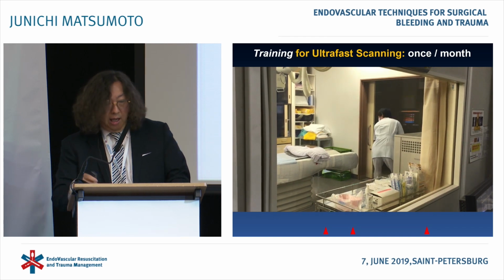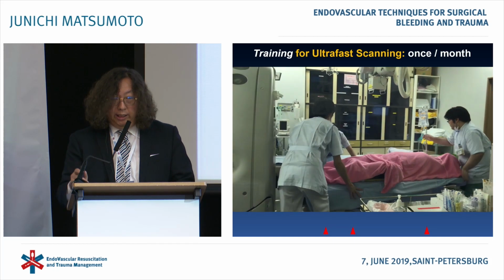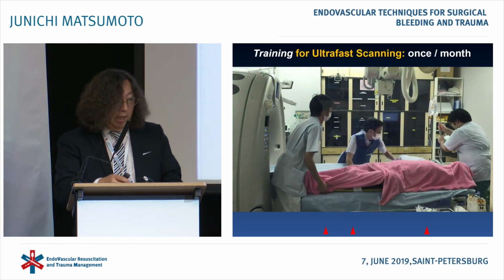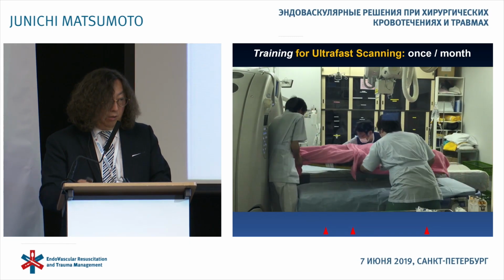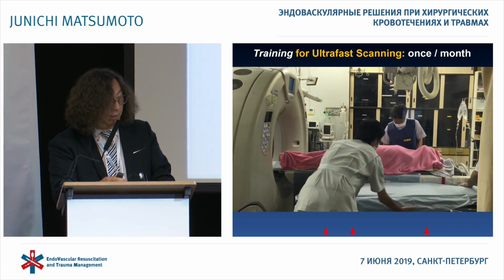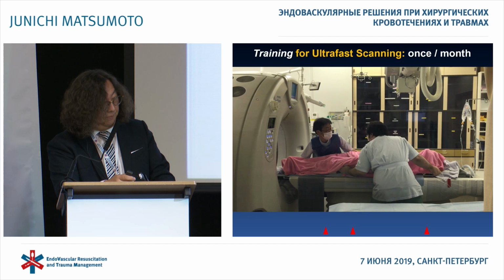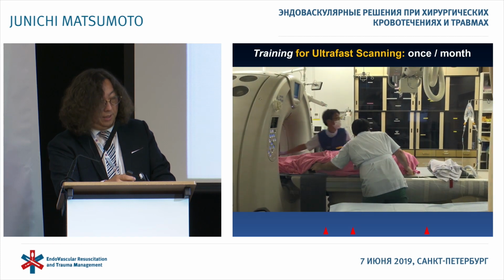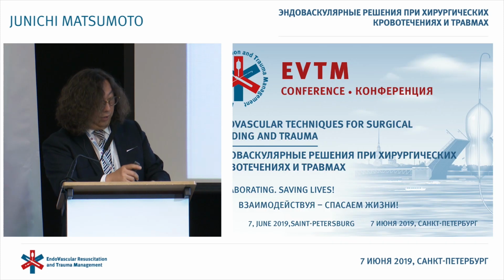Okay. And this is the movie from the training, and we use an 80-kilogram phantom doll. Could you forward to the first arrow? We set the patient on the scanner. Could you move to the first slide, first arrow? No, to the first arrow as we practiced.